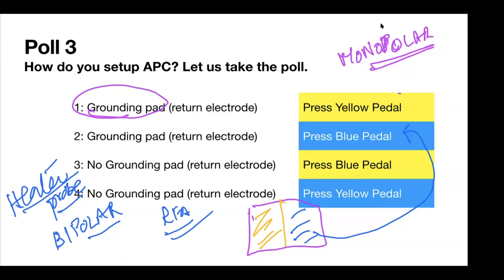Maybe somebody who does radio frequency ablation, because Joseph and I don't, wants to unmute themselves and comment. You don't need the grounding pad for the radio frequency ablation. Right. Thanks, Joanne, for helping us out. Radio frequency ablation is again a bipolar device, from electrode to electrode and comes back. So something to keep in mind.